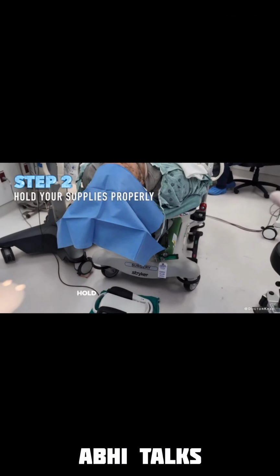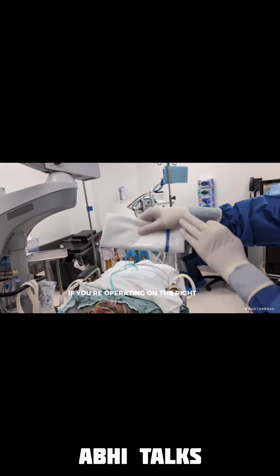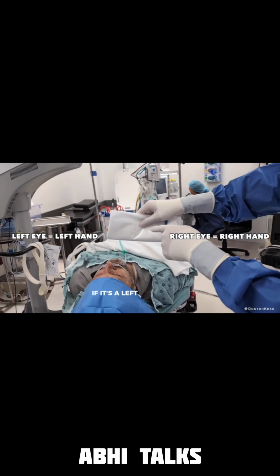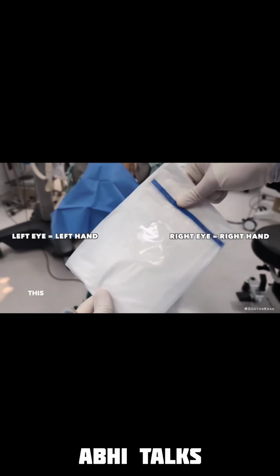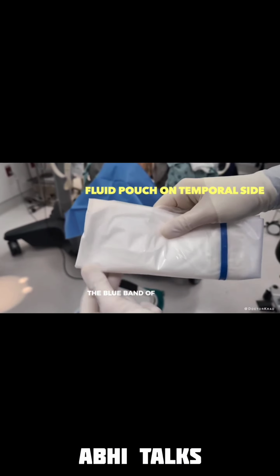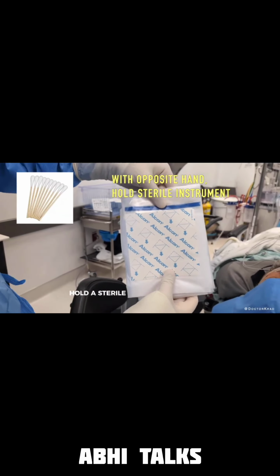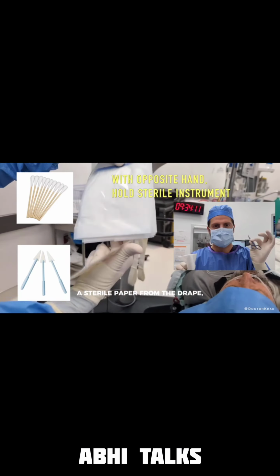Hold the drape with your hand that correlates with the eye you're going to operate on. If you're operating on the right eye, hold the drape with your right hand. If it's a left eye surgery, hold the drape with your left hand. This keeps things in order during the hustle and bustle of your surgery day. The blue band of the fluid containment pouch needs to be by the patient's ear. With the opposite hand, hold a sterile cotton tip, Weck-Cel, a sterile paper from the drape, or draping scissors.